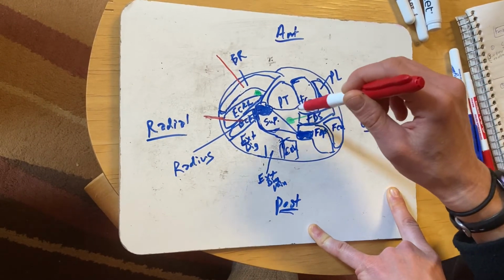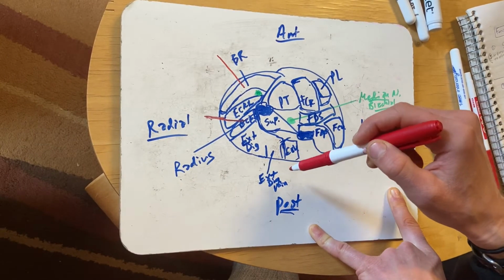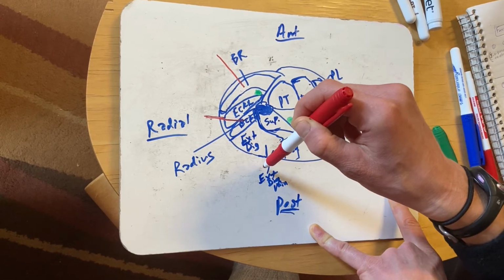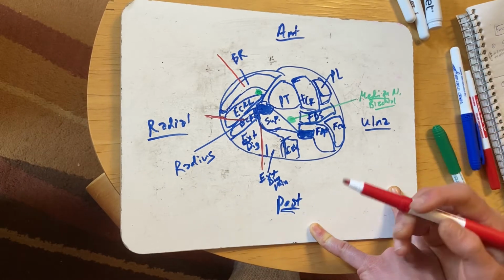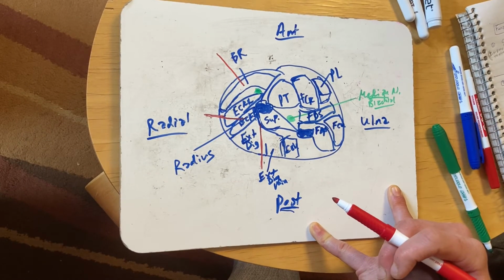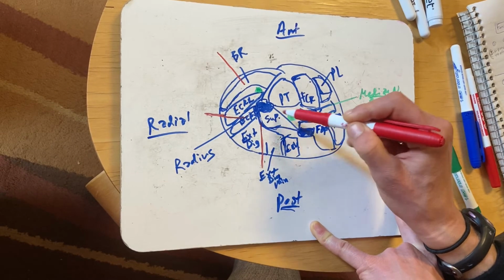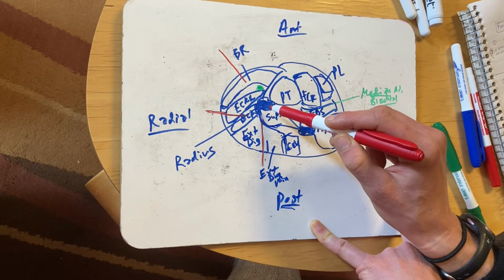So median nerve, brachial artery closer to the elbow. So we don't want to go in that direct trajectory. I want to angle, if I'm targeting an extensor digitorum, back towards the radius. The other muscle we can think about needling is the supinator muscle, and particularly with this muscle, because it is deep, we do want to utilize that trajectory aiming for the radius as our backdrop.